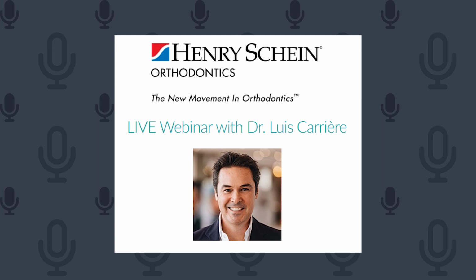How do you do arch expansion in conjunction with the motion appliance? We cannot do arch expansion in conjunction with the motion appliance in class 2, but we can do this in class 3 malocclusion because class 3 malocclusion has the motion appliance on the lower teeth, so we can simultaneously do the sagittal correction and transversal in class 3.